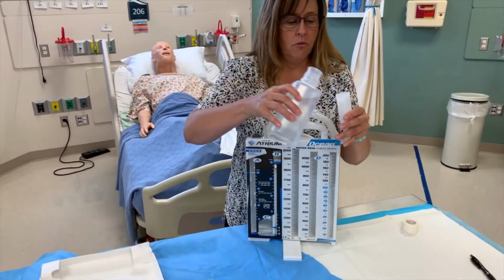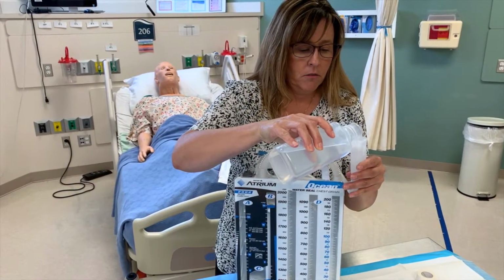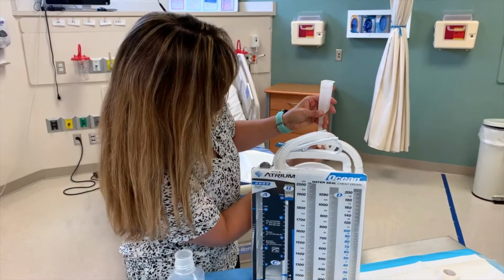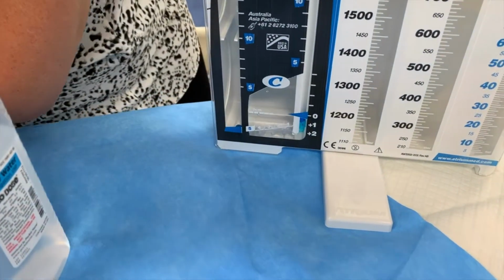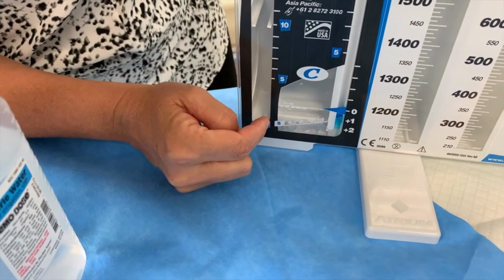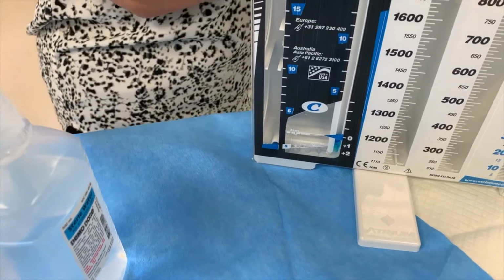Fill up your funnel with your sterile water, and then open it up and raise it until you get to that 2 centimeter line. All right, so we're at the 2 centimeters. That's what you're going to fill it to. That's what you need to do right there.